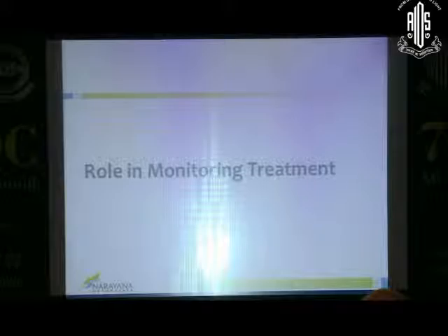Imaging in terms of role of monitoring treatment, I shared this case yesterday. This was a case where a partial ROP laser was done and we were waiting for some amount of the posterior pole to vascularize. We put in some supplement laser knowing fairly well that this ischemic retina needs treatment. The mother of this child was a VR surgeon who was supposed to show up a week later but missed 2 months of follow-up and then ended up with this band.